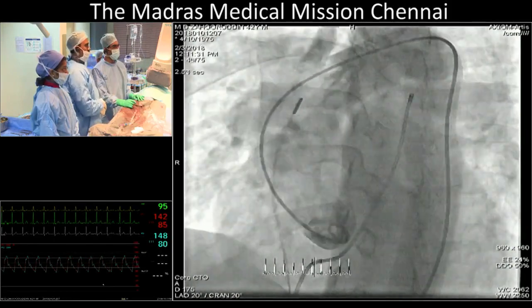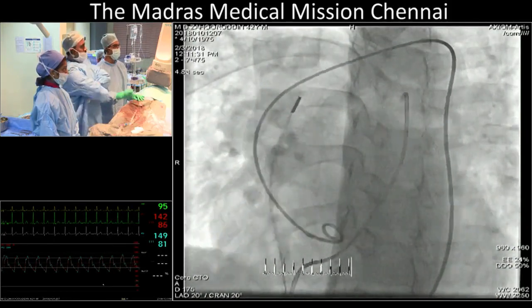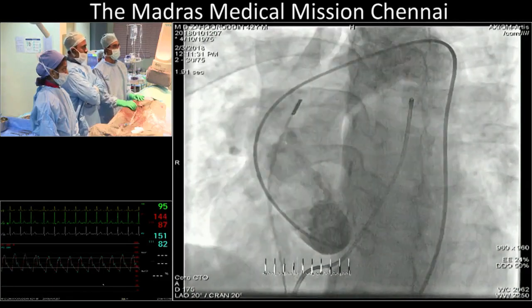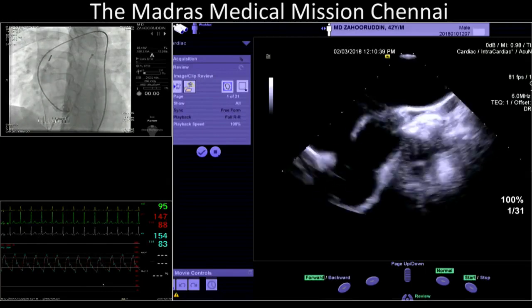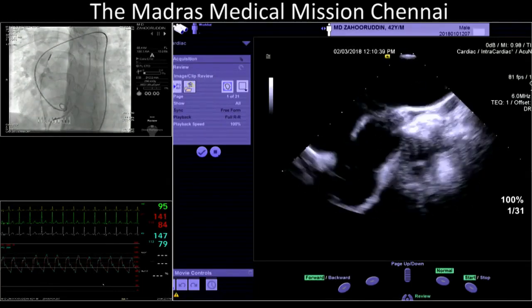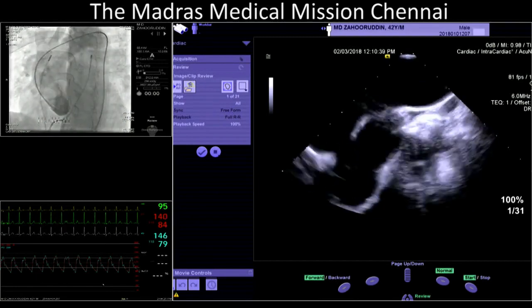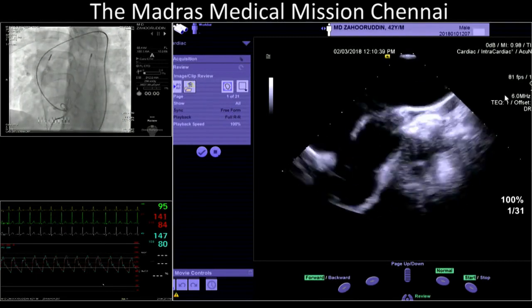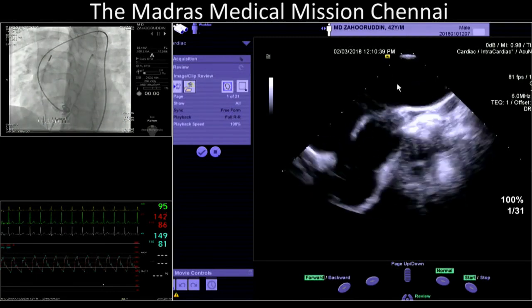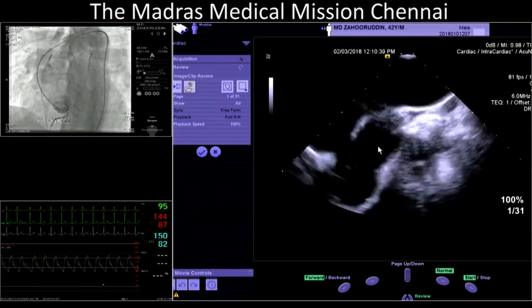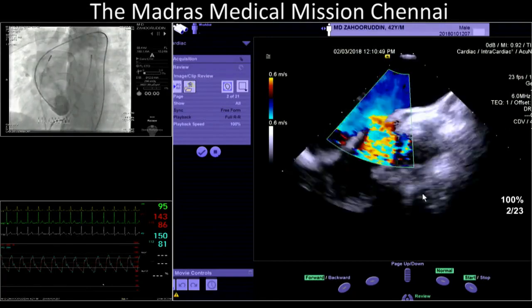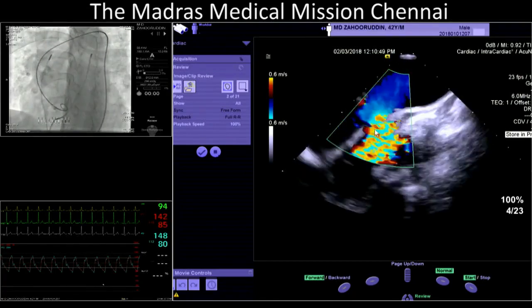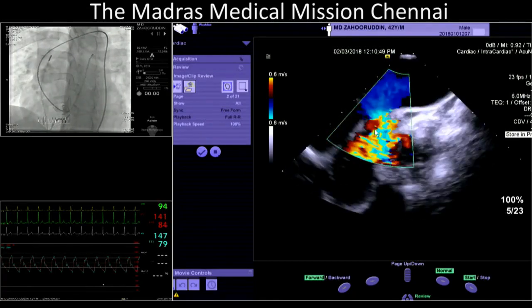Show the intracardiac echo. So what we have is the ICE catheter in the superior vena cava. The proximal large vessel is the ascending aorta, and the distal vessel is the pulmonary artery. And that is the AP window — we are able to see the color flow from the aorta into the pulmonary artery.